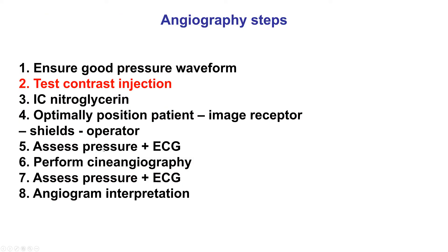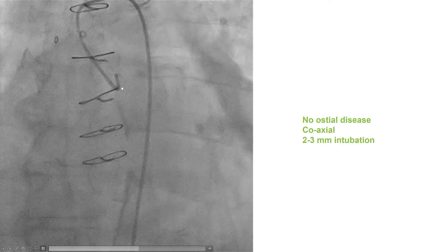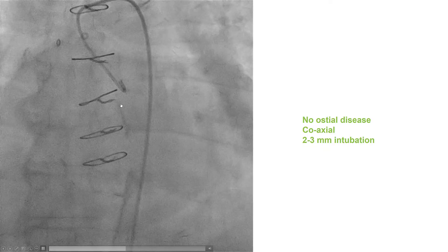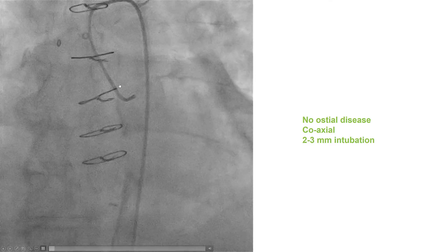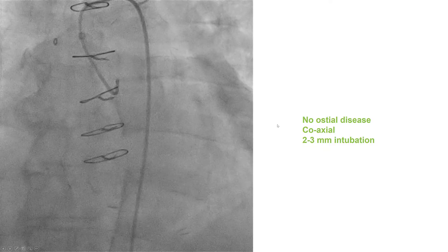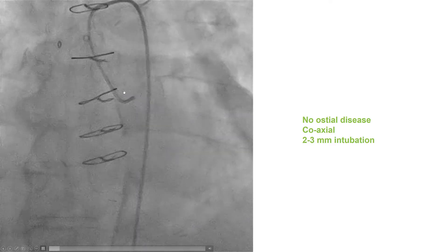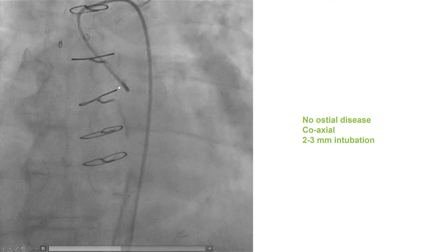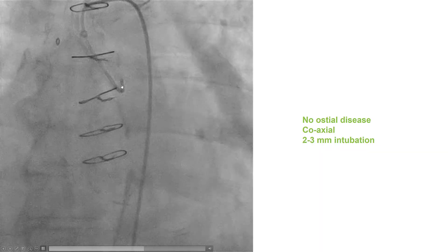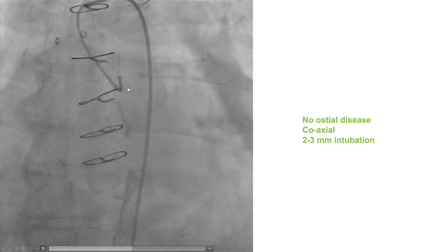Step two is to give a small test injection of contrast. This is an example of a JL4 getting into the left main. A small amount of contrast, one to two cc's, is injected for many reasons. The first is to confirm that the catheter is actually engaged. The second is to check that there is no osteal disease. Third is to check that the catheter is coaxial with the vessel, which is not in this particular case — this catheter is actually pointing towards the roof of the left main. And then, to ensure that the catheter is not too deeply intubated — usually we want 2-3 mm intubation. In this case, the catheter is indeed not deeply intubated.